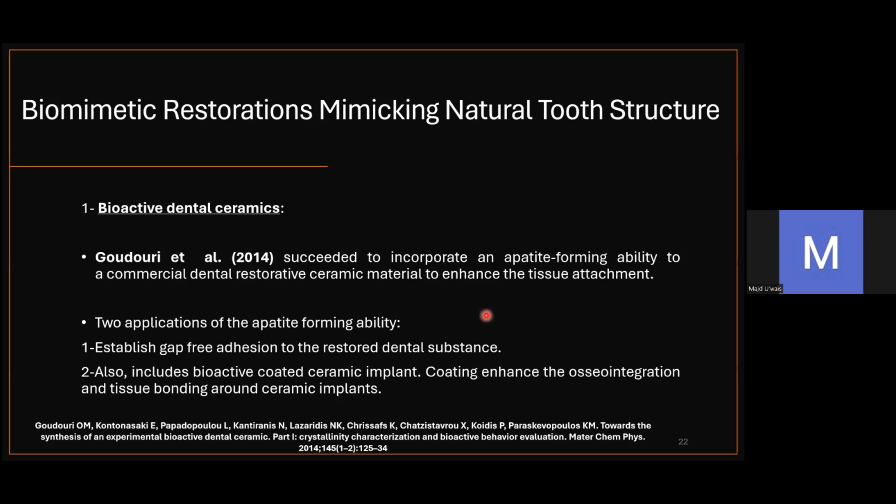This bioactive coating, I can benefit from it in two applications. The first application, establish gap-free adhesion to the restored dental substance. The second one, which we are familiar with, is the ceramic implant. When we use this ceramic material as an implant, coating will enhance osseointegration and tissue bonding around ceramic implants.